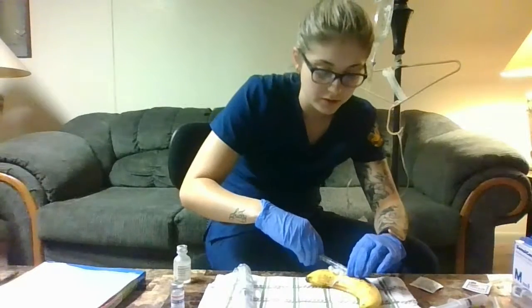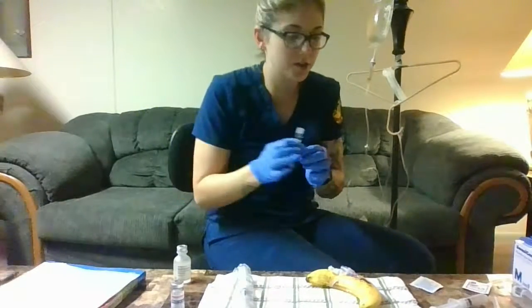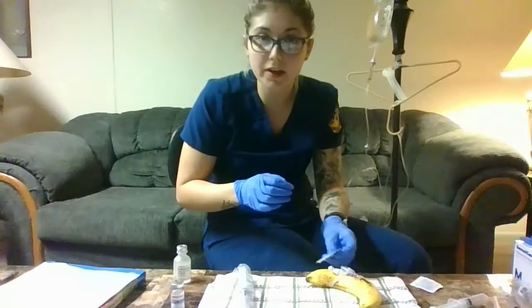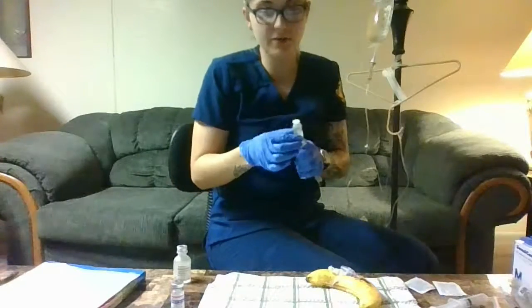We are going to remove our medication syringe. We're going to clean the port again. And then we're going to flush again with 5 milliliters of the saline.